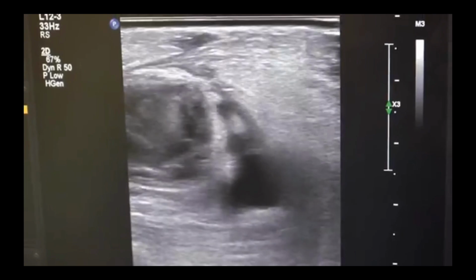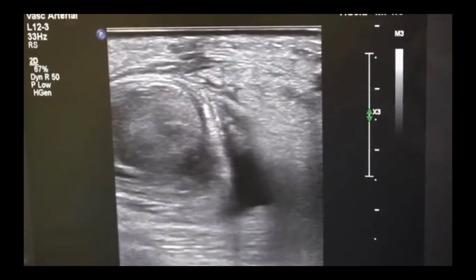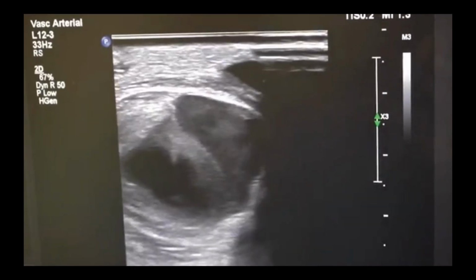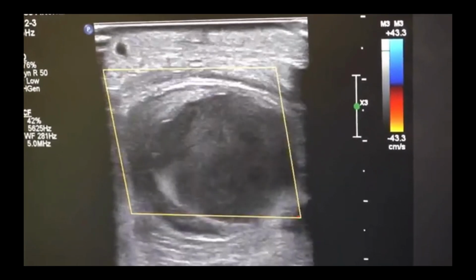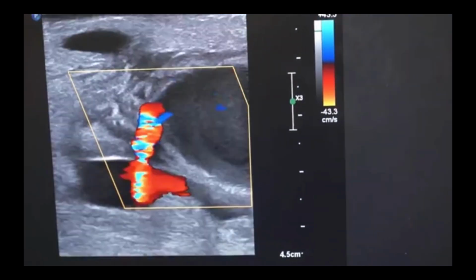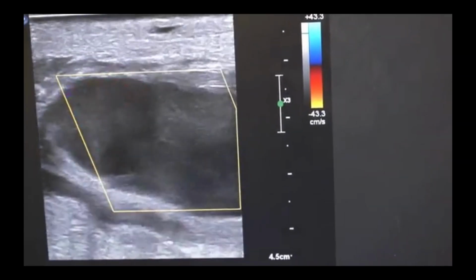Obviously, injecting close to the brachial artery, we've got to be careful we don't get any reflux which might cause ischemia of the hand. And here you can see it's quite a large pseudoaneurysm. There's relatively slow flow within the cavity of it when you get a bit more inferiorly. And there you can see it longitudinally. There's the neck. And we'll pass more inferiorly, and you can see the slightly slower flow in the larger cavity.